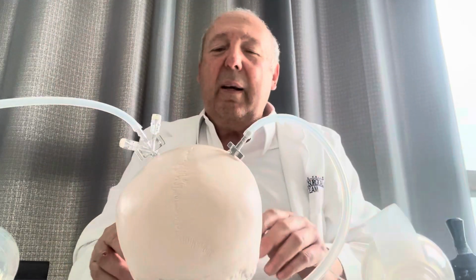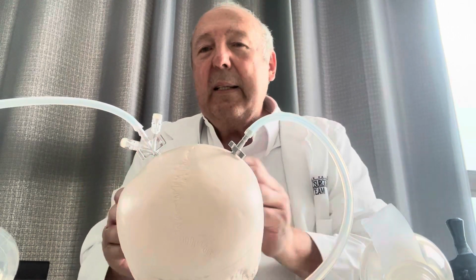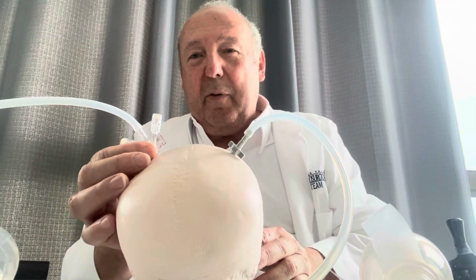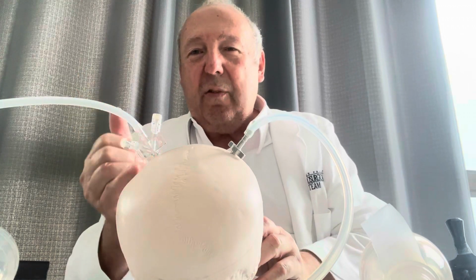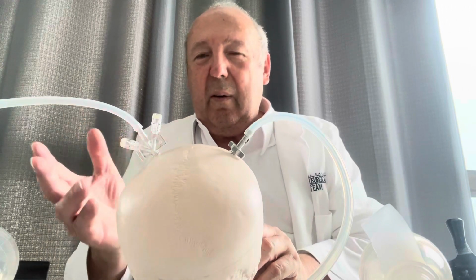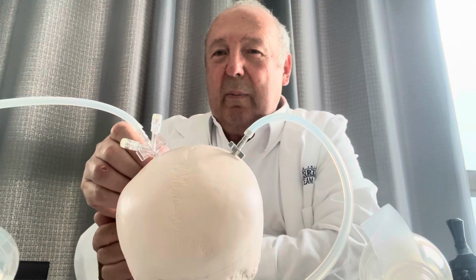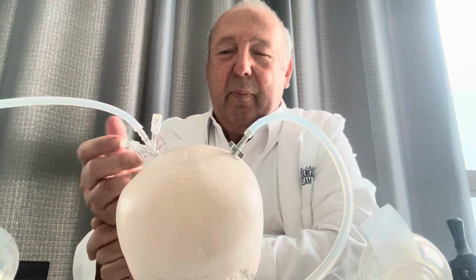So my conclusion, therefore, is that the NASP, this newer device, addressed the pitfalls of the SEPS. It has better fixation to the skull. It is transparent. It allows injection of thrombolytic agents or anticoagulants to prevent clotting. Allows aspiration of the subdural space and irrigation of the system if elected to be done.